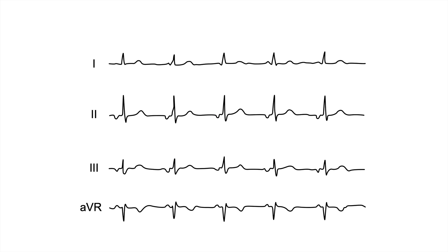Here we can see regular QRS complexes with P waves preceding them. However, one thing is really puzzling. The P waves are rather flat in lead 1 and they're negative in leads 2 and 3. Plus, they're positive in lead AVR. And we've already learned that in AVR, P waves always have to be negative in sinus rhythm. So according to our criteria, this can't be sinus rhythm.